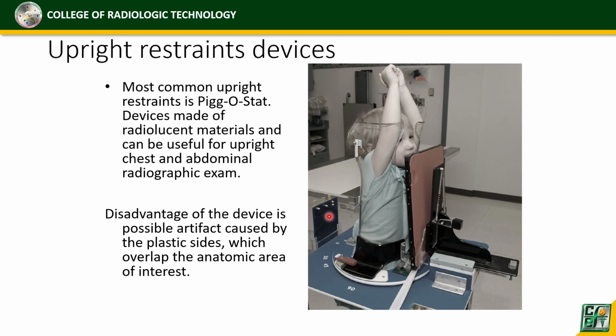Okay? So, nakakita na ba ako ng pigostat? Hindi pa. Sa picture lang. So, wala pa akong nakikitang hospital na may pigostat sa Philippines. Okay? So, kasi kung meron ang bawat hospital na ganyan, napakadali lang mag-x-ray ng pediatric patients, no? Isushoot mo lang dyan yung pasyente, yung bata. Oh. Wala na, kahit mag-iiyak yung bata dyan. Diba? So again, that is the pigostat.